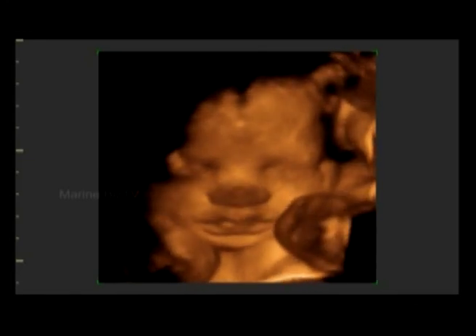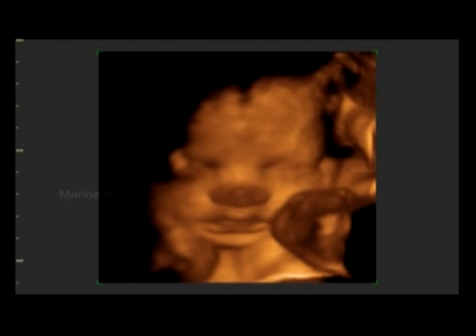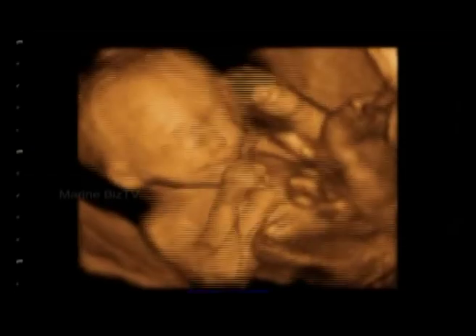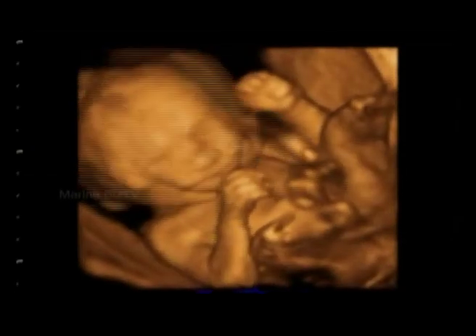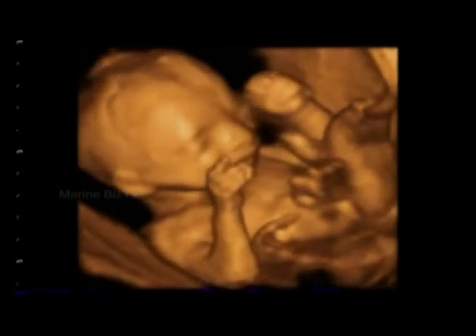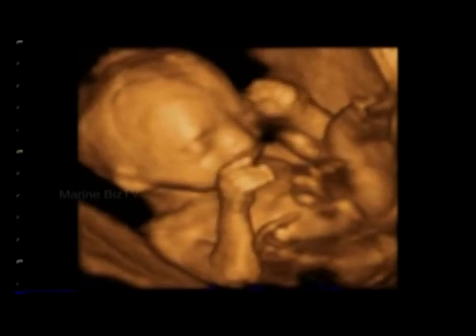Then one more aspect that I would like to discuss on the use of 4D technology in pregnancy is something that I've observed. When seeing a baby's face like this, you can see a lot of fetal emotions. This is one example where you can see the baby smiling, and when the mothers see their baby's emotions, either smiling or otherwise, the first thing they take advantage of, or get to know, is the face.